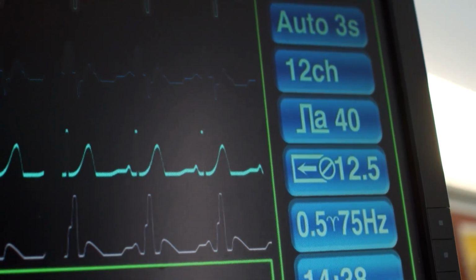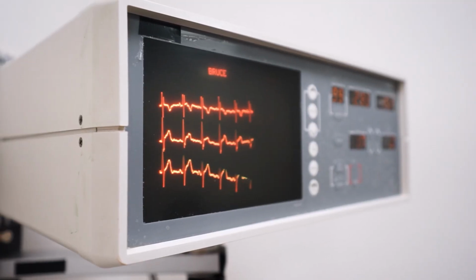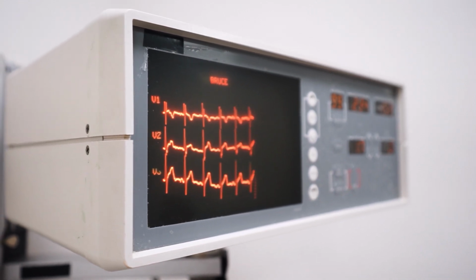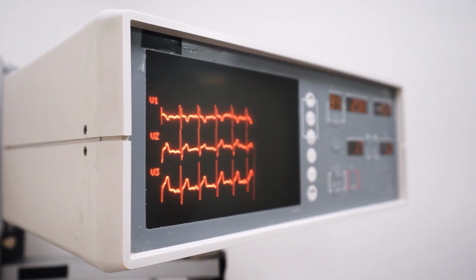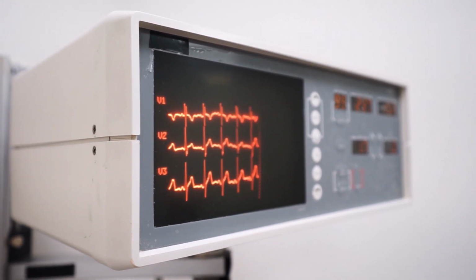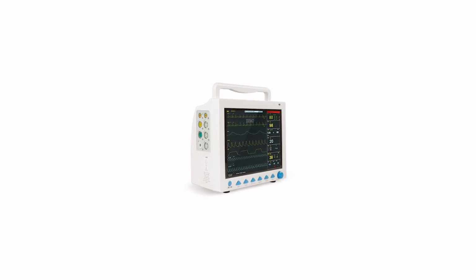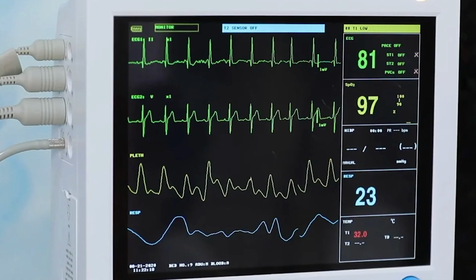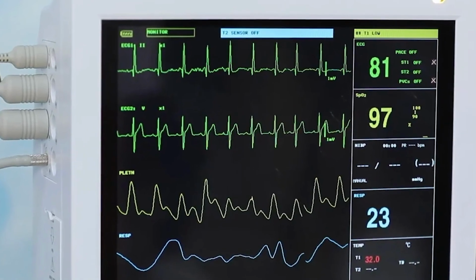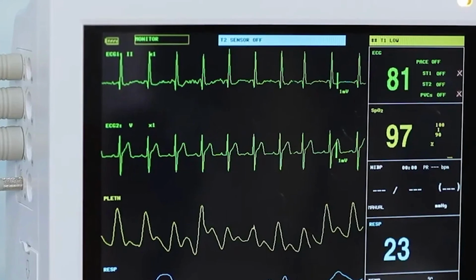Now, a reasonable question is, how did the backdoor in the Contec CMS 8000 go undetected for so long? It went undetected for an extended period due to these factors. There's the misinterpretation as a legitimate feature. The functionality was initially mistaken for an alternative update mechanism despite lacking standard security measures.